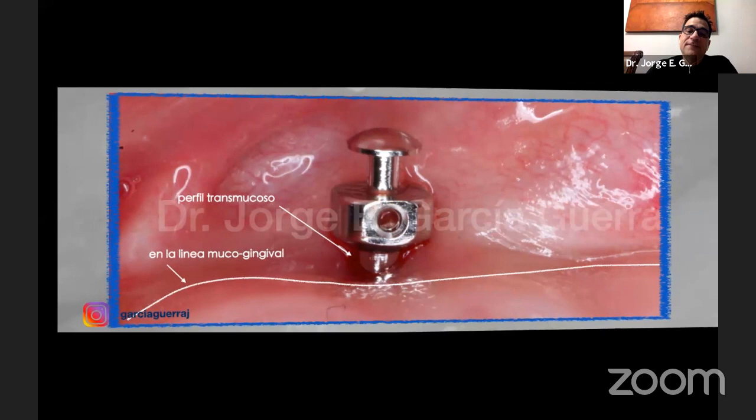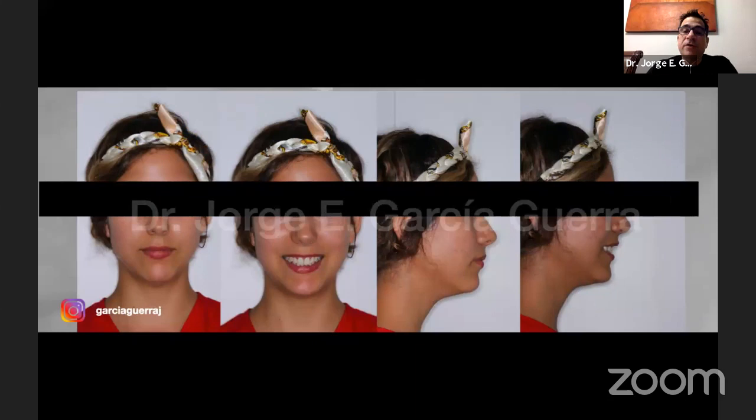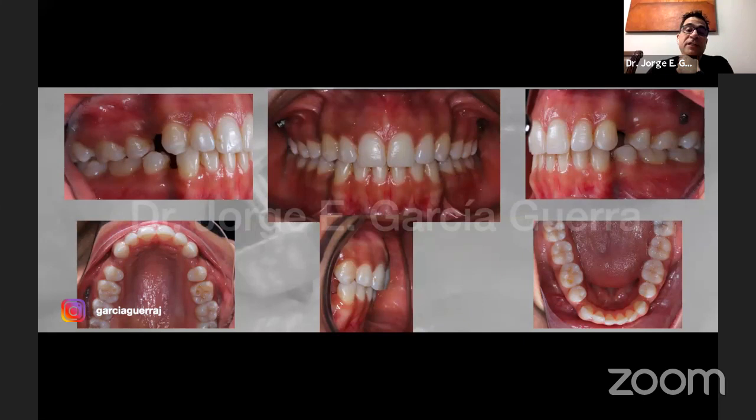Okay, we're going to see another case. This was a patient who had had another ortho treatment, and she had a very straight profile. Personally, when I saw the case, I thought, in my opinion, she wasn't an extraction case, but the extractions were done because she thought her profile was a little bit protruded. Now you can see in the picture that she had some mini implants that the doctor placed in the other treatment, but he never used them. He just put them there, put on brackets and started closing spaces. And you can see how we have an overbite there. This situation is very common: in the lower arch, the spaces close faster.